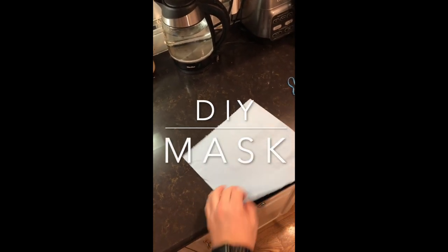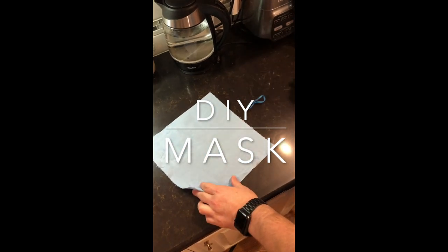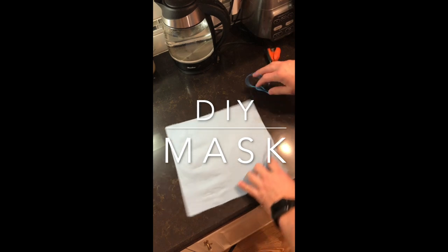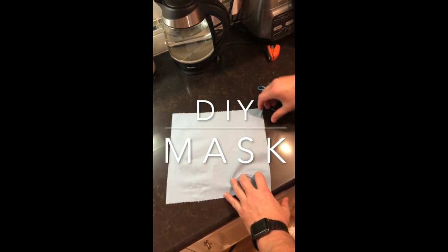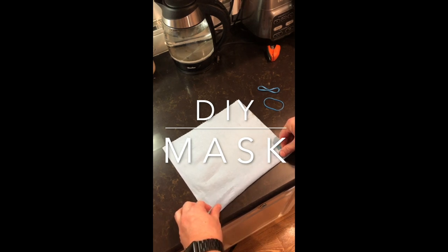Hello YouTube. I'm going to show you an easy way to make a mask at home since there's such a shortage, and if you find them they're about eight to ten bucks a piece. These are actually the blue shop towels, but you can use any paper towel.